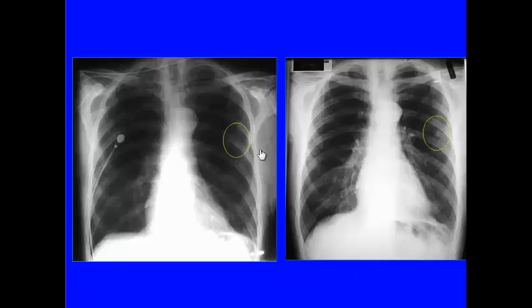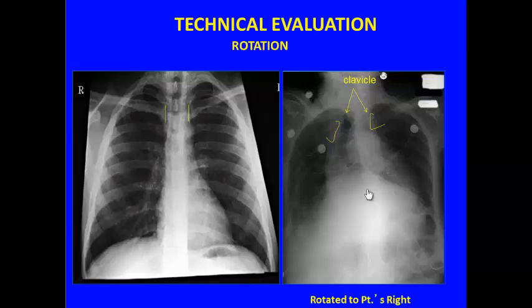So see, as an example right here, here's the same patient, one x-ray. It's a little bit hard to see, but there is actually a pulmonary nodule right there overlying that rib, and that x-ray is a little bit darker, harder to see, and here's that nodule. So that's how that overexposed or overpenetrated x-ray could be harder to see.